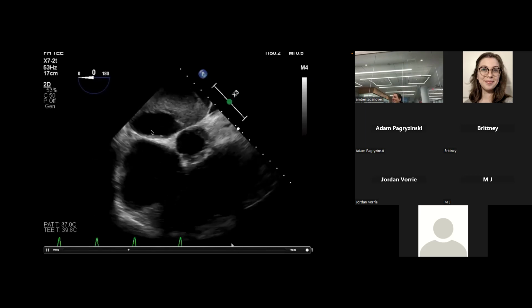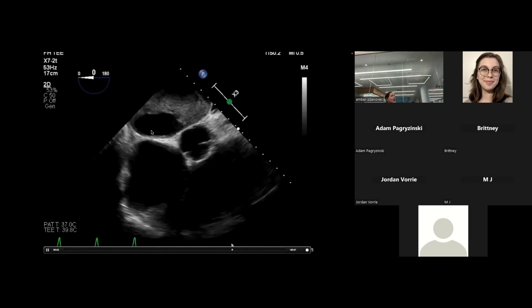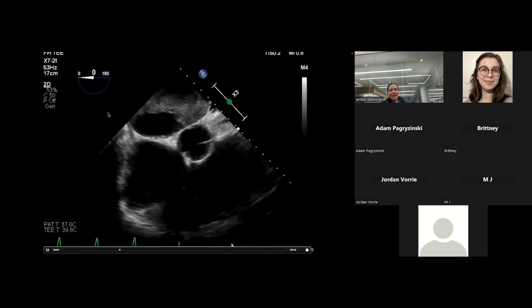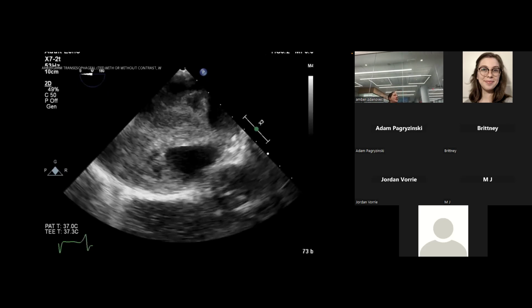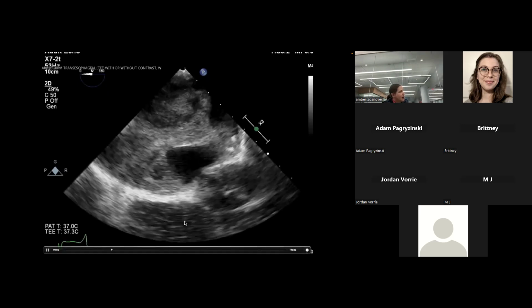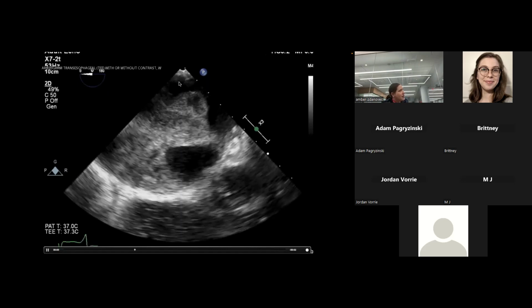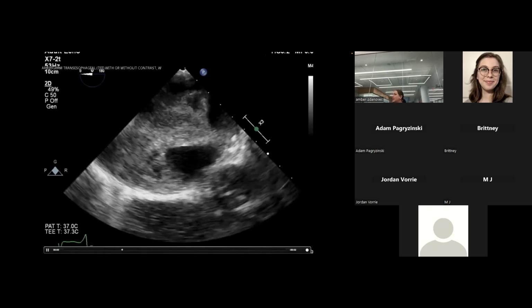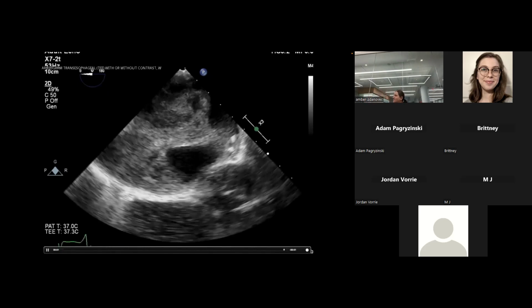Maybe I'm weird, but LA looks like it's full of a bunch of stuff that should... Yeah. Maybe blood. Yeah. And so this is actually clot. Okay. And when you go even further, definitely. So this is just zoomed in and turned a little bit. To orient you, this is the RA down here, aortic valve, and this is just zoomed in a little bit. And this is your LA. And this man's LA was completely filled with clot, with just like a tunnel from the pulmonary veins to the mitral.